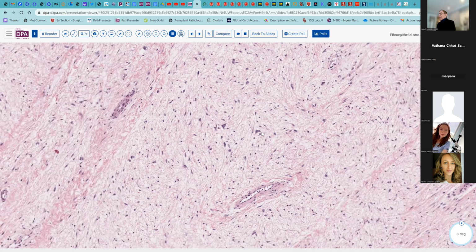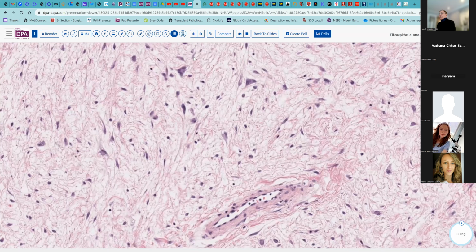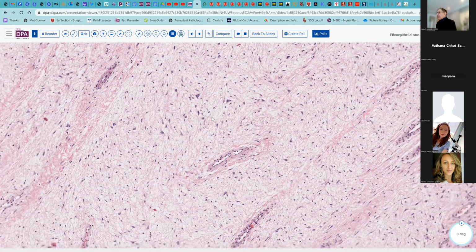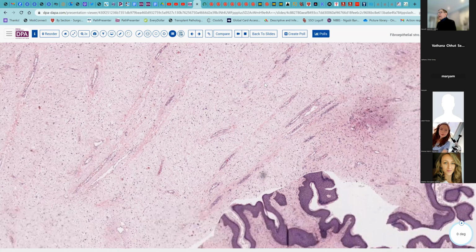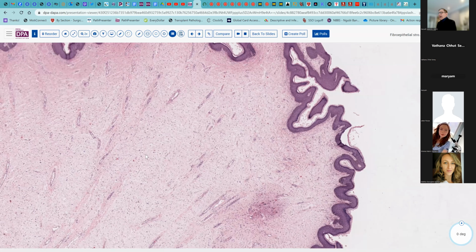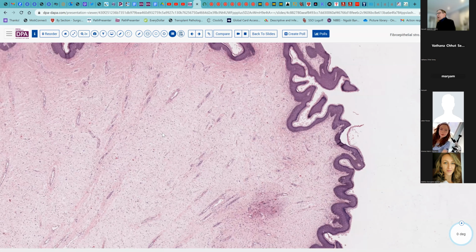Like here we can see these rosette-like cells, or stellate cells. So this is characteristic of the urogenital fibroepithelial stromal polyp. This is probably not different than a fibroepithelial polyp in other sites of the body. The only difference is that it has these rather distinctive and somewhat atypical or slightly bizarre stromal cells.